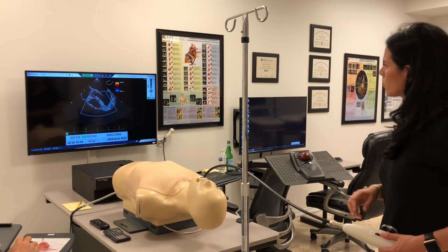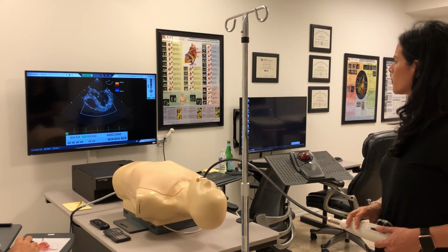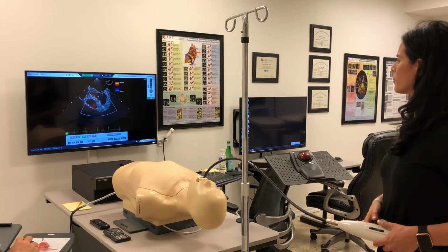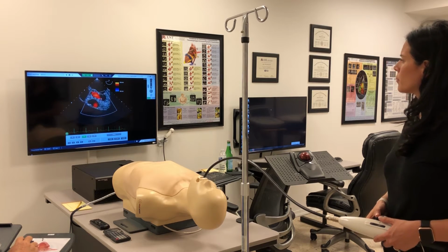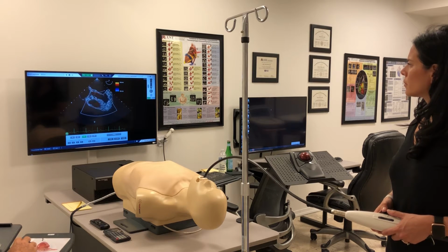Good. That's nice. So we'll put a little color here. All we see now is laminar flow towards the probe. So that rules out any obstruction like hypertrophic obstructive cardiomyopathy, a membrane, SAM, some kind of subaortic ring or tunnel, rules all those things out pretty quickly.